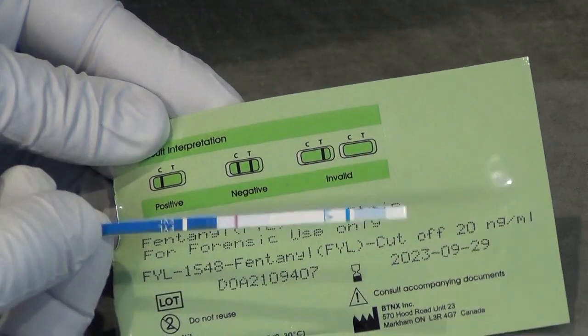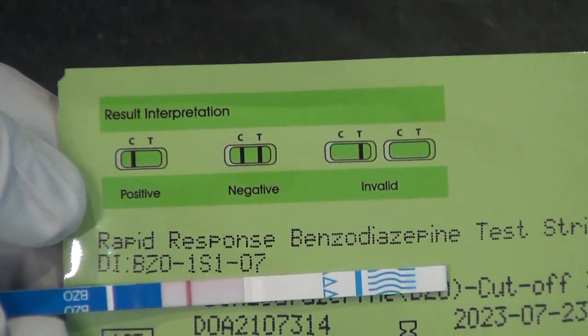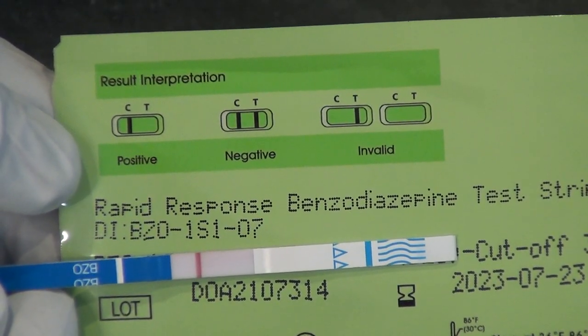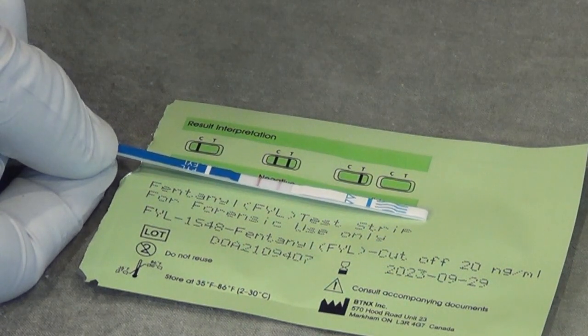If only one line is present and it is closest to the shorthand of the chemical name, the test is positive. This means the sample contains a substance for which you are testing. If there are two visible lines, the test is negative for the substance for which you are testing.